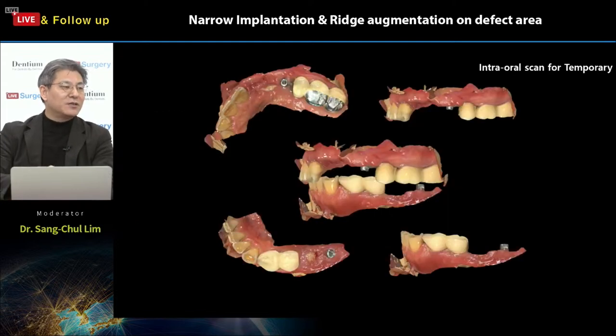And this surgery was actually performed by Dr. Chung almost 3 weeks ago. Now, let's move to the follow-up after surgery. Let's take a look at the intraoral scan view.